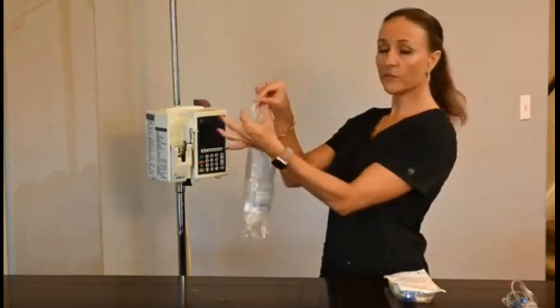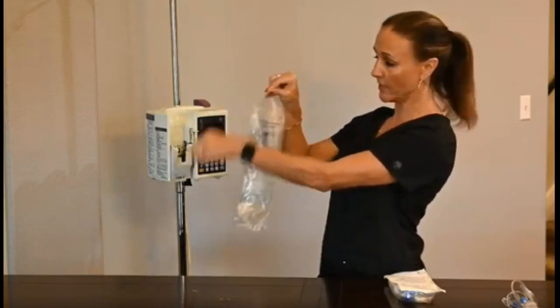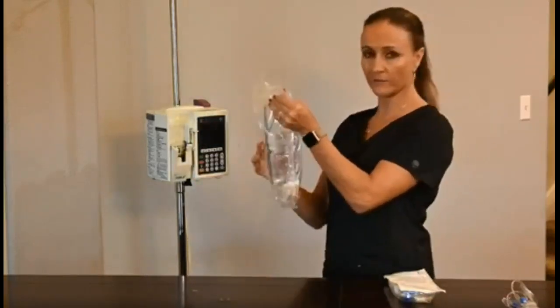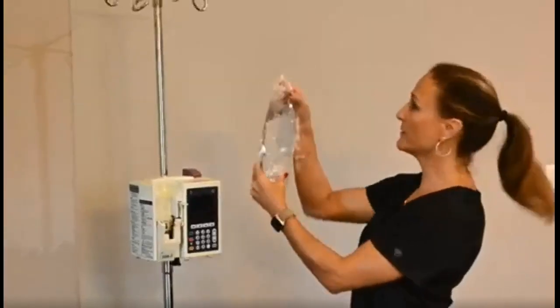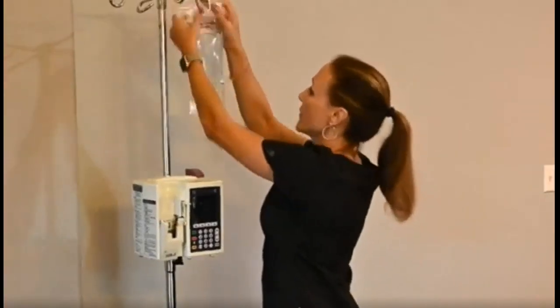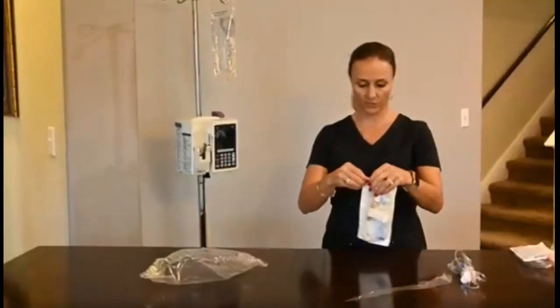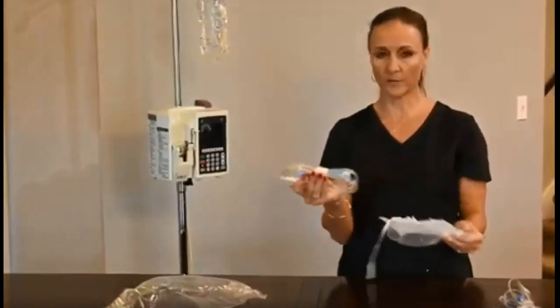An easy way to remember with these bags how to open it is there's usually a part up here that you would just tear and it comes right off. Make sure the bag is not expired. I would get the bag, I would hang it up on the pole. Then I would get my primary tubing. With the primary tubing as well, it has a little ridge that makes it easy to open. And I would take out my primary tubing.